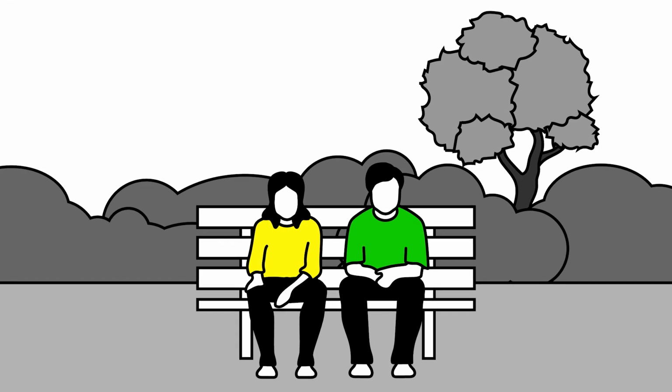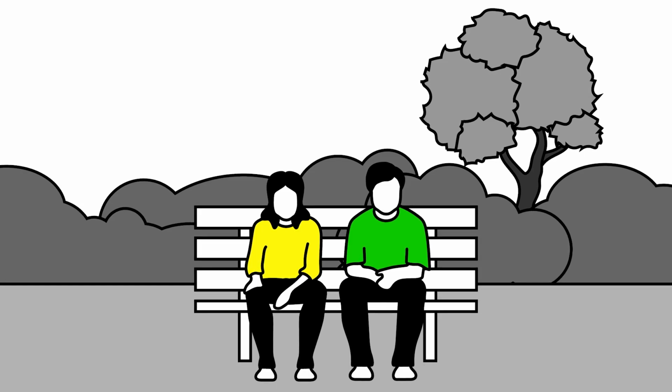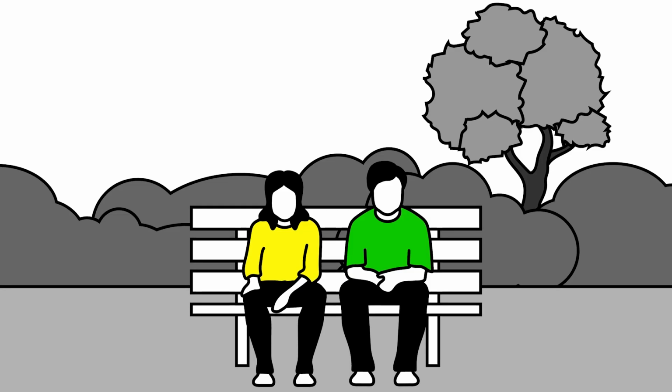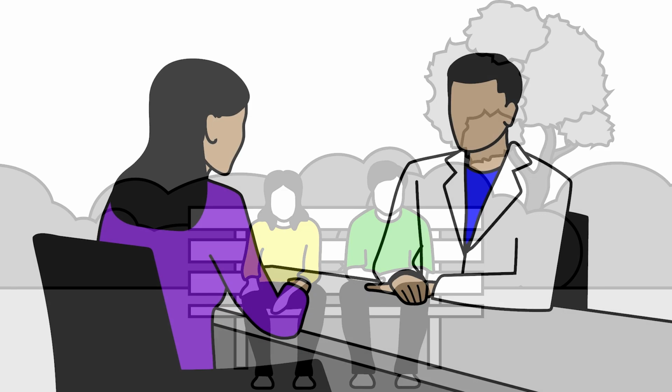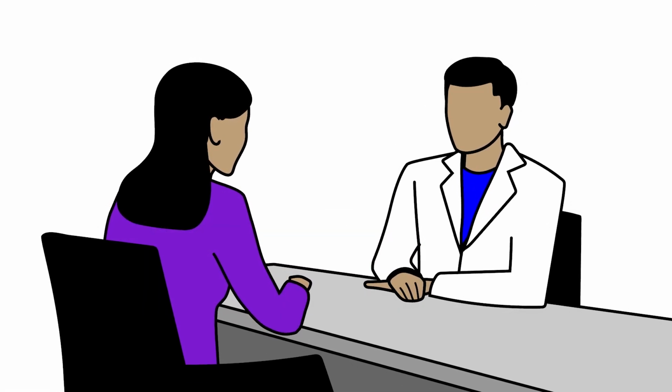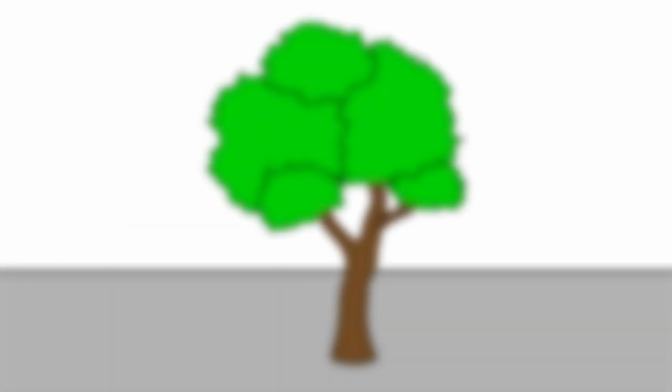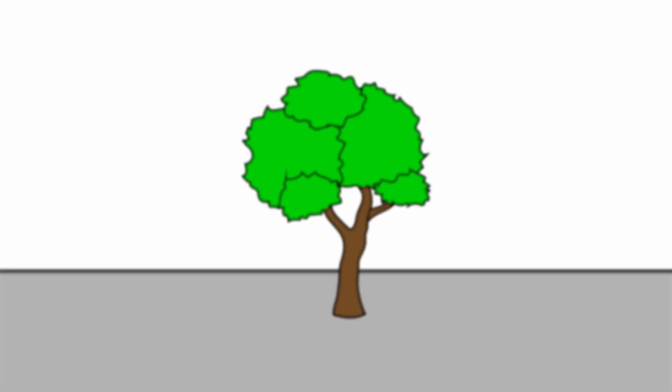When you're watching a soccer game, admiring your neighborhood gardens, or reading the signs in the aisles of your grocery store, you rely on your distance vision. And when you visit your eye doctor, checking your distance vision is an important part of the appointment. How well you see things far away is called your distance acuity.